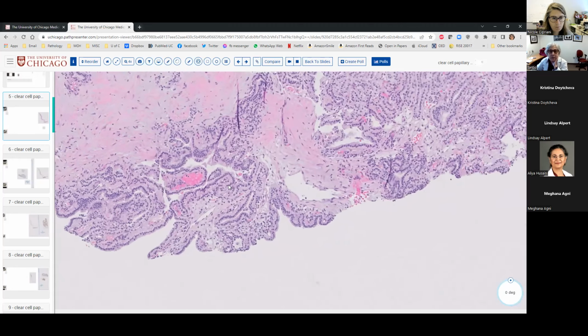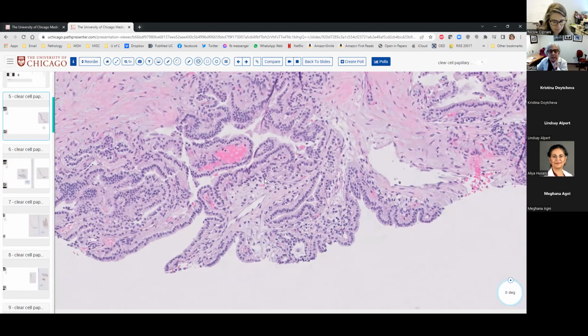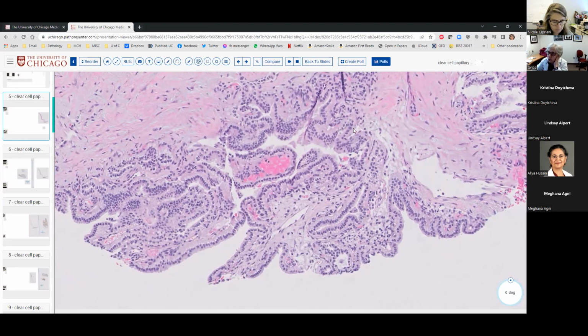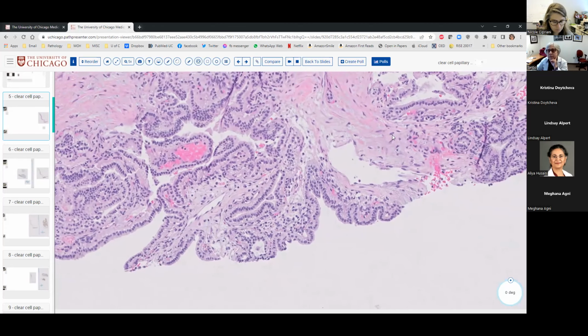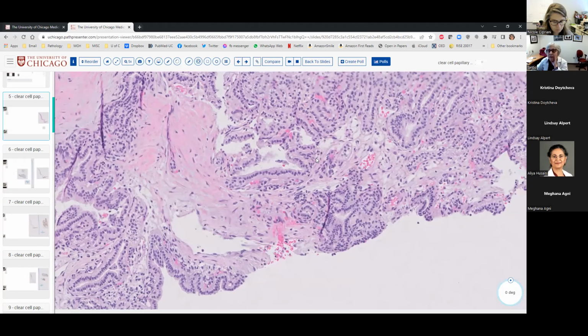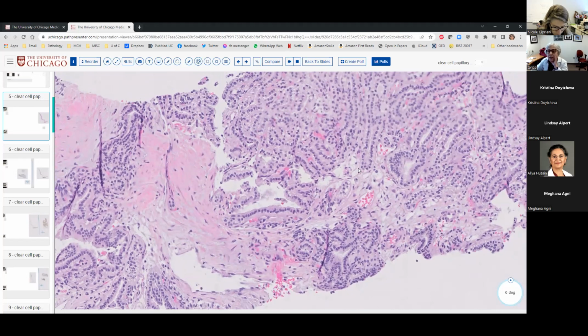In this specific case, when you really look at the disc, clear cell is less likely because you don't have this very rich capillary network, which would be typical for clear cell. Therefore, clear cell in this situation is less likely.